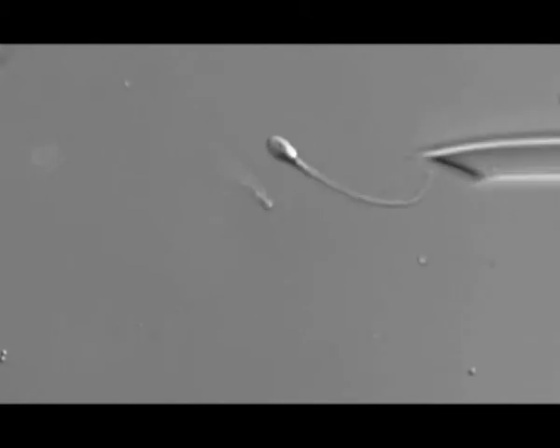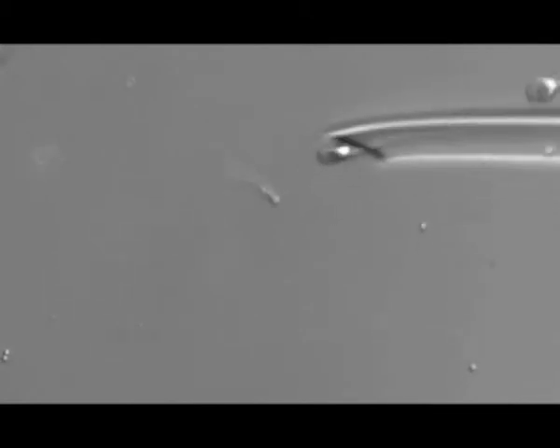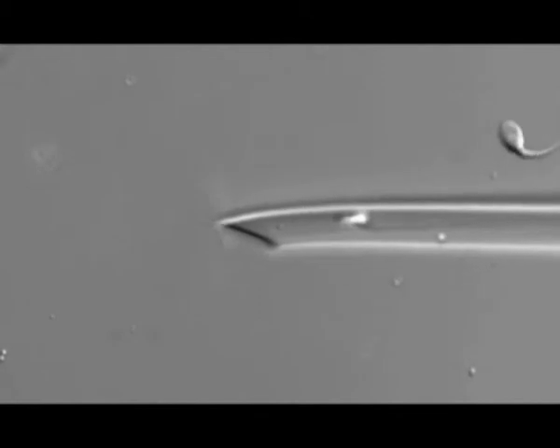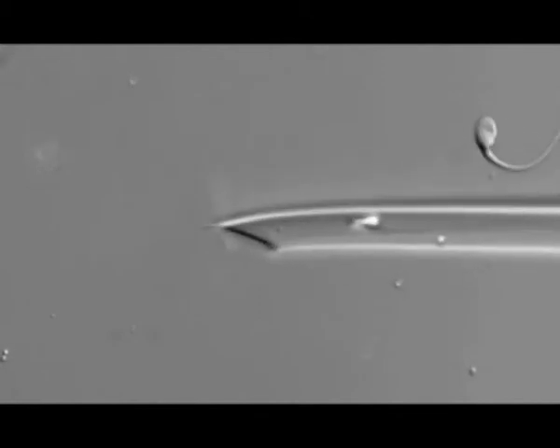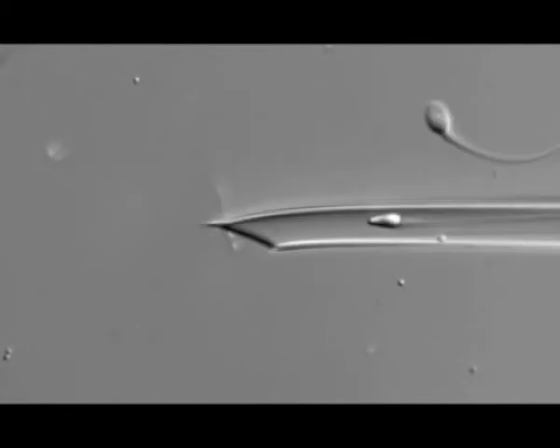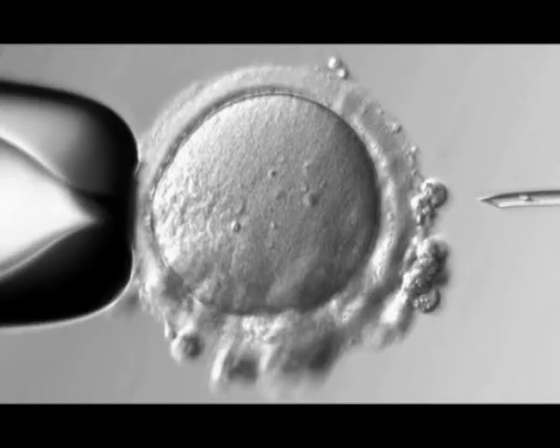Immobilize the sperm and aspirate it into the ICSI pipette. After the sperm has been aspirated, it's immediately injected into the cytoplasm of the oocyte.